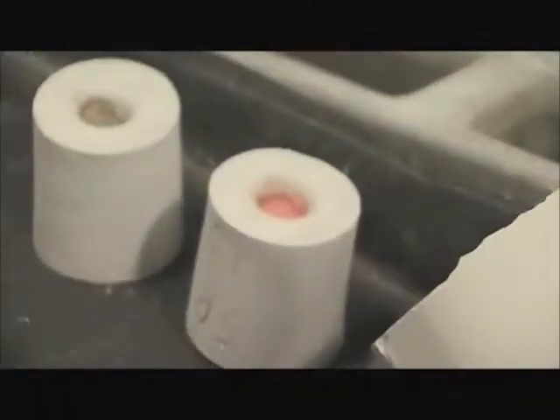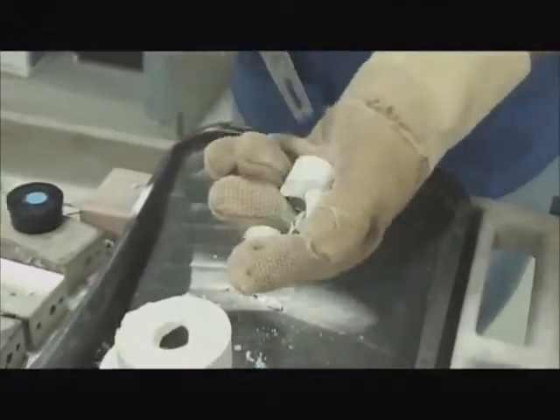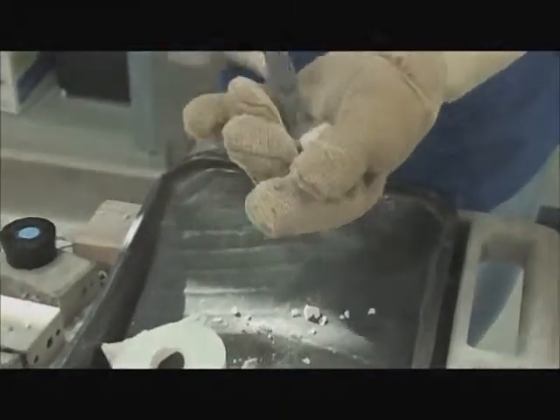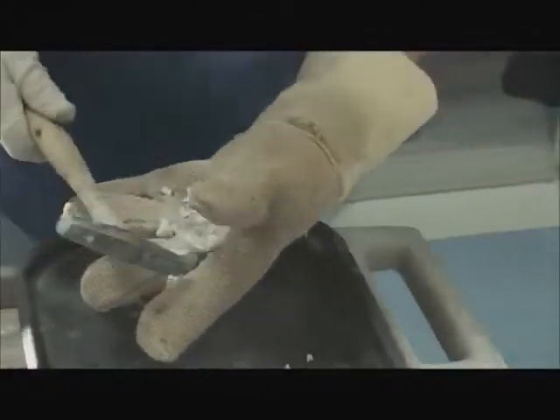When recovered, the casting is sandblasted with aluminum oxide. When de-spruing, a separating disc is used to separate the casting from the metal sprue. The surface of the metal coping is then finished with stone or carbide burrs and checked for fit and accuracy on the master model.